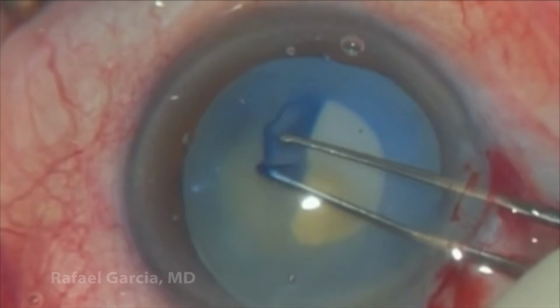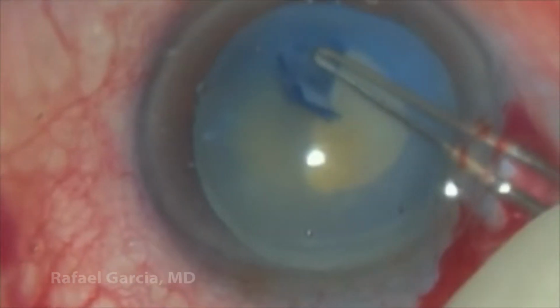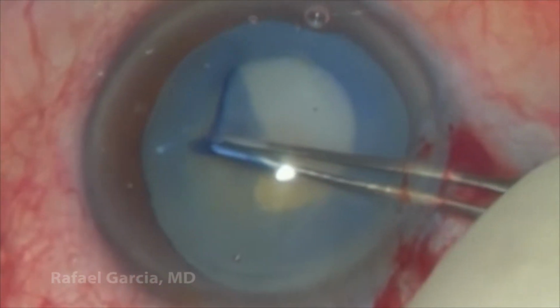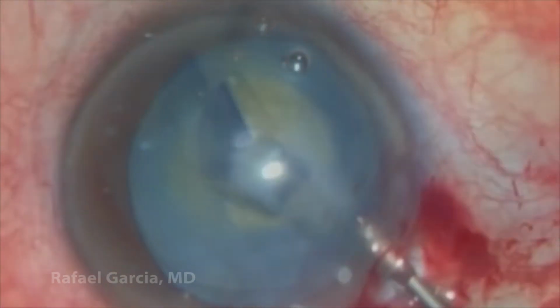We can see how this milky fluid comes out of the bag and is aspirated with the needle, so that the pressure inside the capsular bag is released without causing any accident. This milky fluid is really the hallmark of an intumescent white cataract.